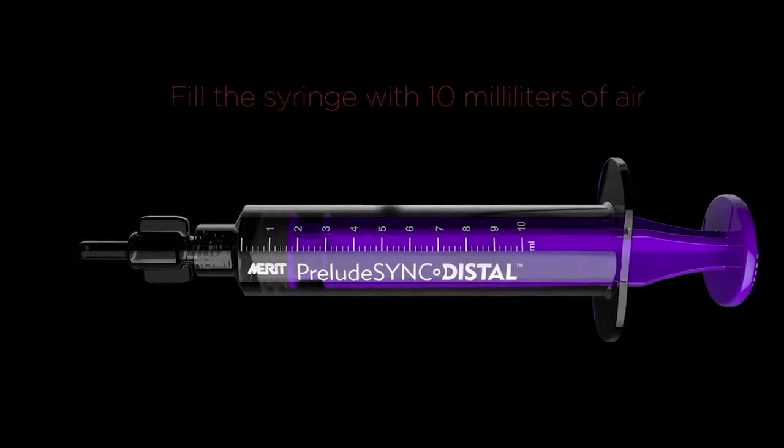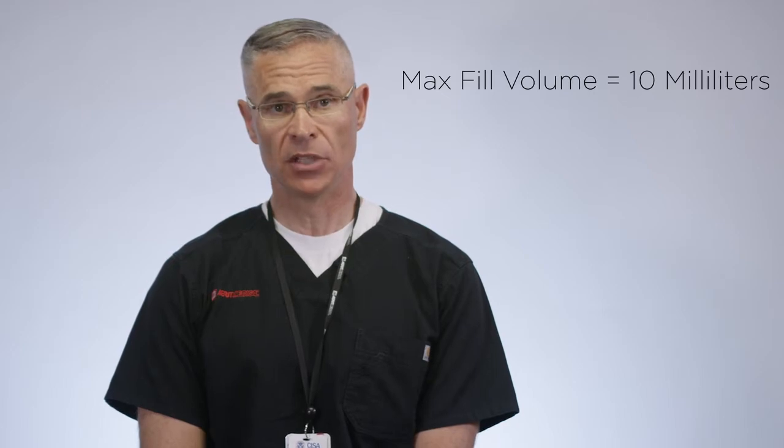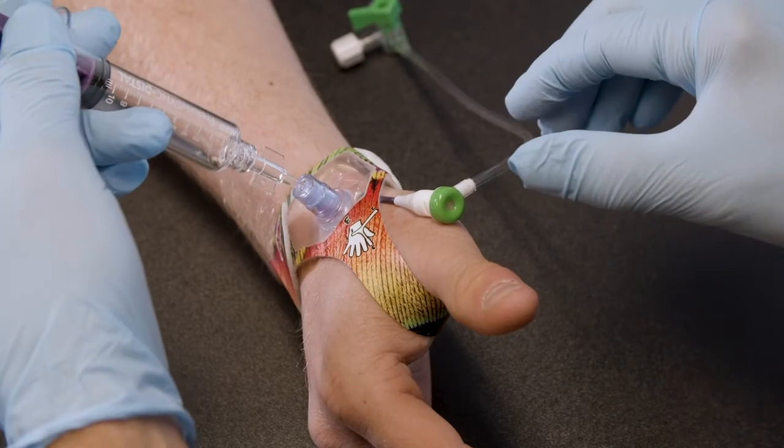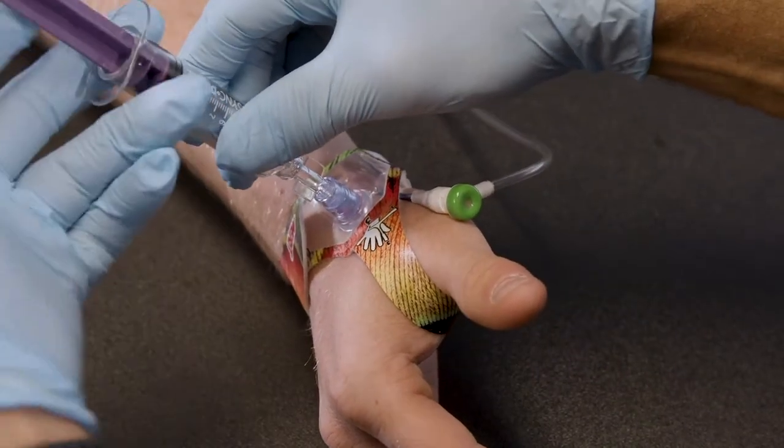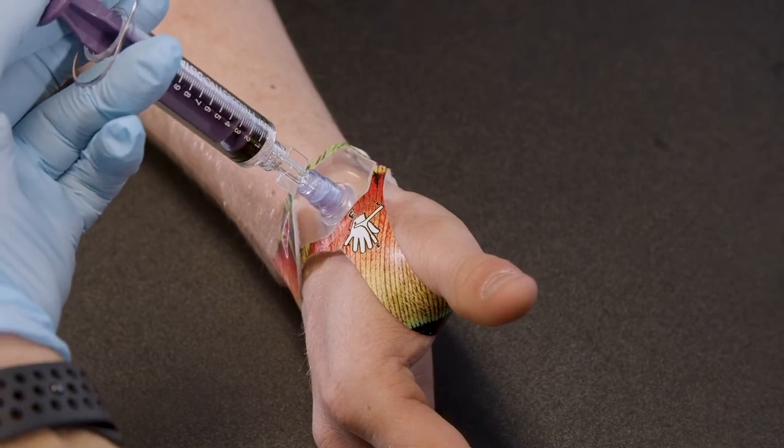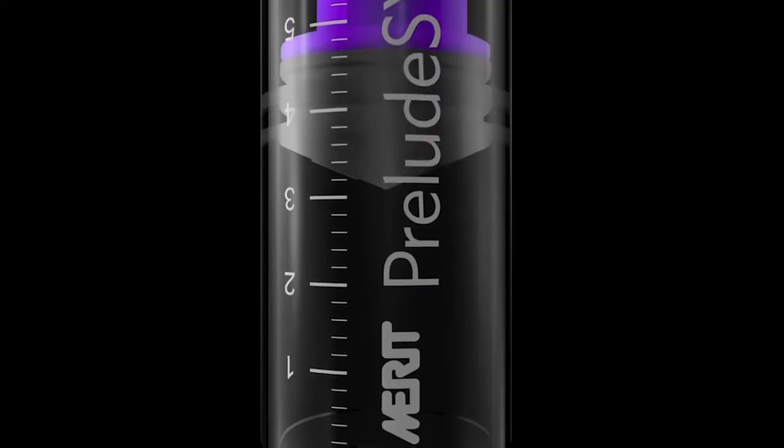Fill the included syringe with 10 ml of air. Maximum balloon fill volume is 10 ml. Engage the syringe into the valve on the top of the device. Slowly inflate the balloon with air while simultaneously removing the sheath. Once the sheath is completely removed, continue to inject air until bleeding has stopped. While inflating, maintain pressure on the syringe plunger to avoid any inadvertent release of air.